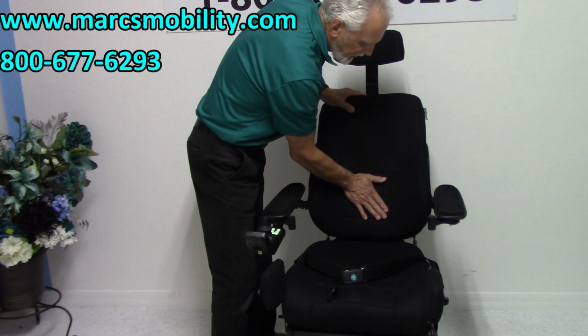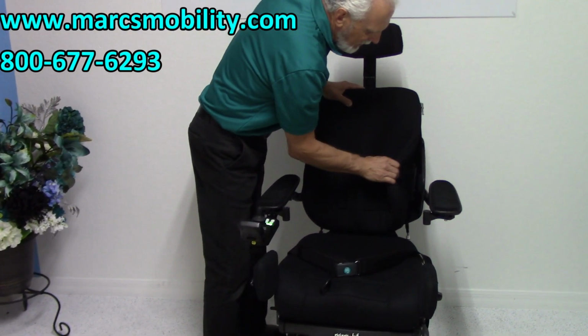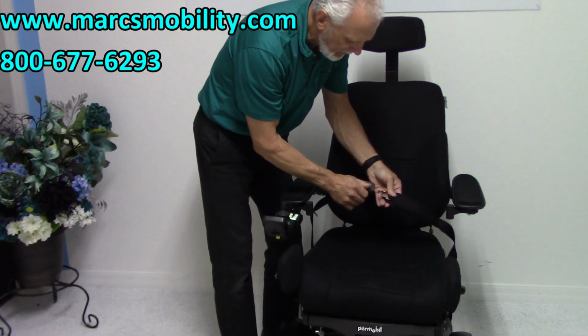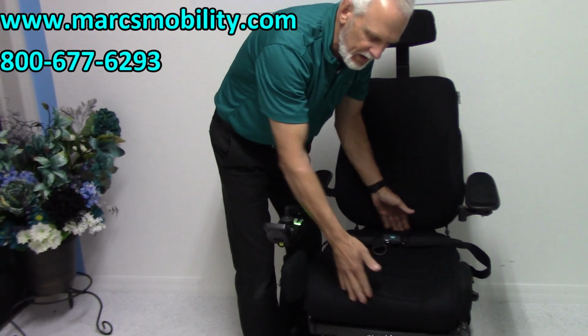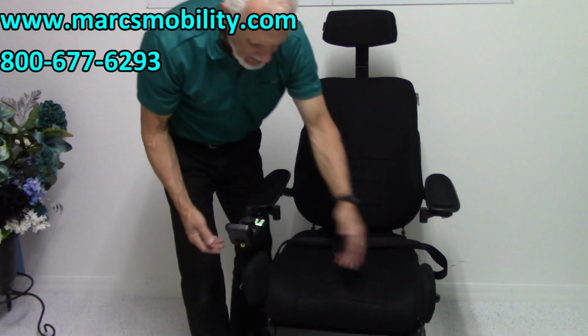And there's also some contour back here that you can remove if there's too much lumbar. You just pull the seat out and pull them out from the back. You do have a safety belt. The seat is 19 by 20, somewhere around there. You've got lateral guards.